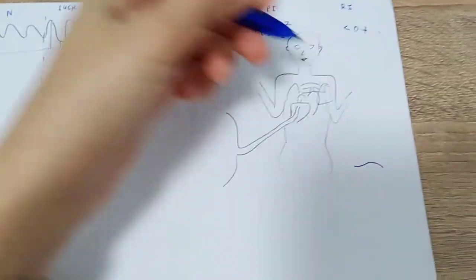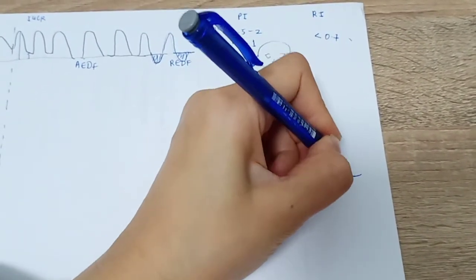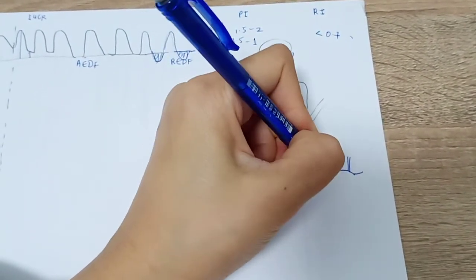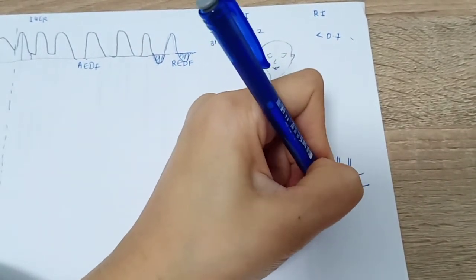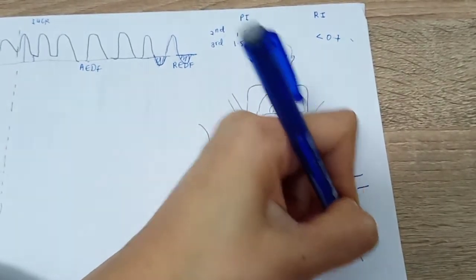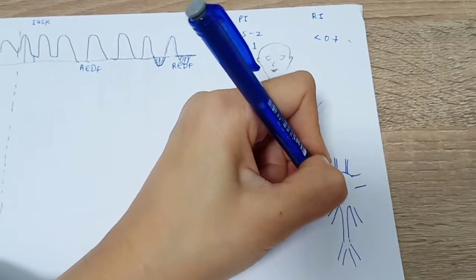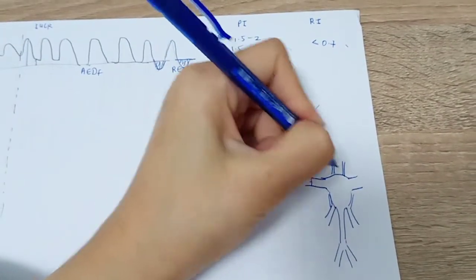So let's see what happens in the middle cerebral artery. We know now the circle of Willis, right? We have the anterior cerebral artery, the middle cerebral artery, and the posterior cerebral artery, which form this circle of Willis. And this is the posterior communicating artery. So we are measuring the MCA here.